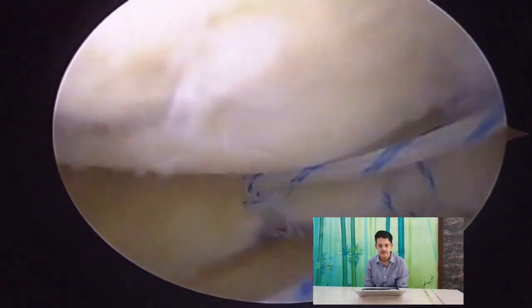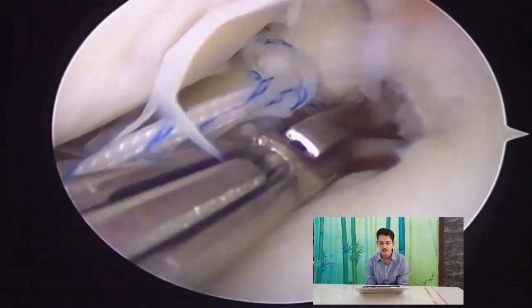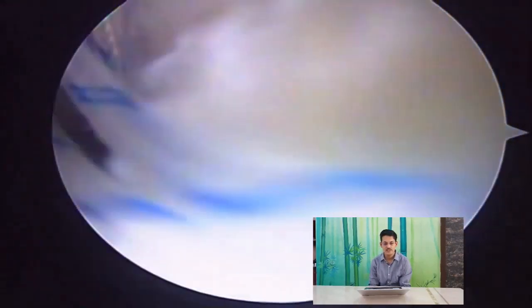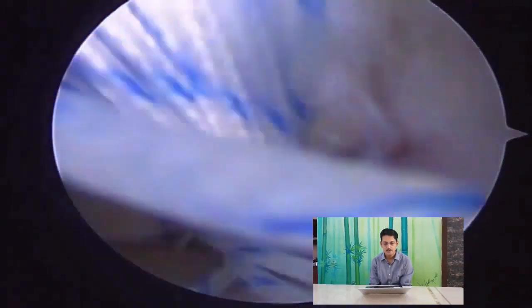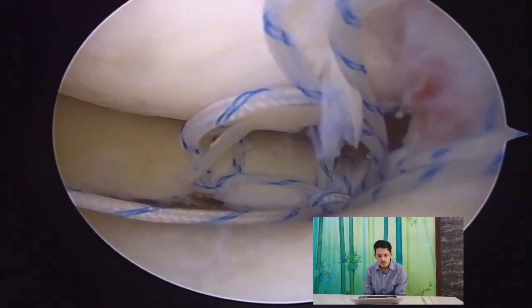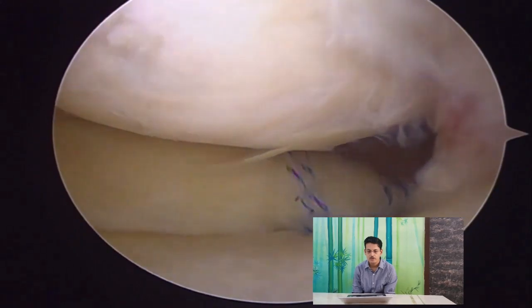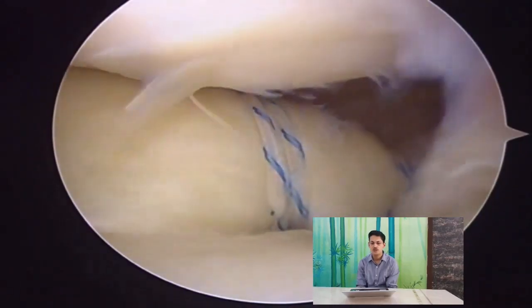Entanglement of sutures must be prevented. Both sutures are passed through the cannula, and the suture lasso is taken out through the cannula and incorporated with both suture limbs. All four suture limbs are passed through the suture lasso and pulled, so that all four limbs can be tied back into the tunnel nicely. When pulled, the whole of the meniscal root is repaired onto itself very nicely in the root area.